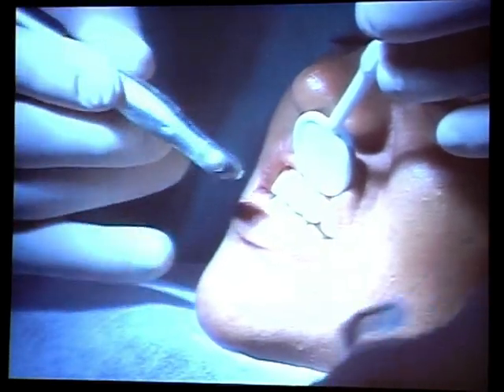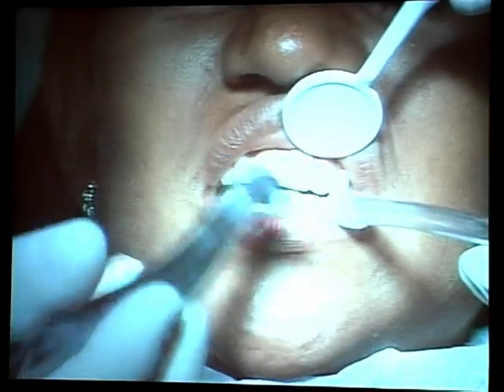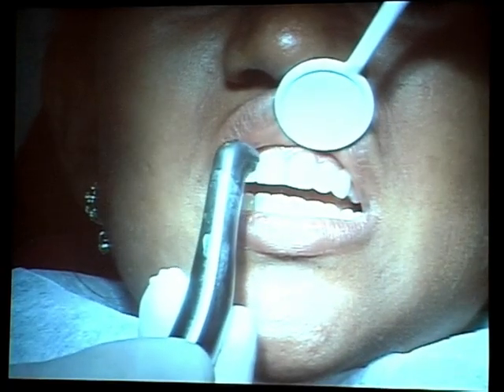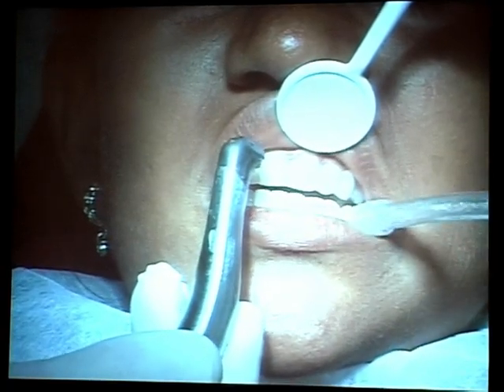Okay, now we'll try to remove the old fillings. A little bit more light, please. And as I said, we do not point perpendicular on the teeth, but always angled. So when we start now, you hear the popping sound.